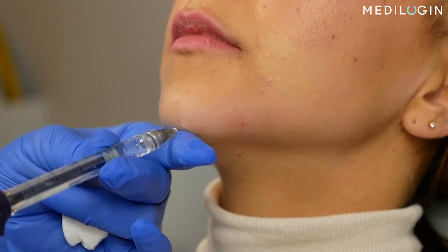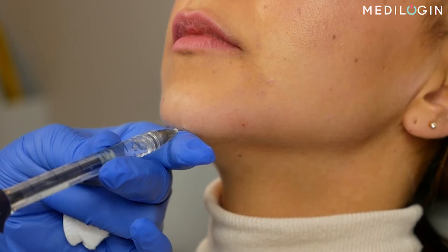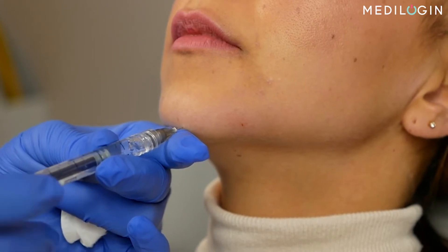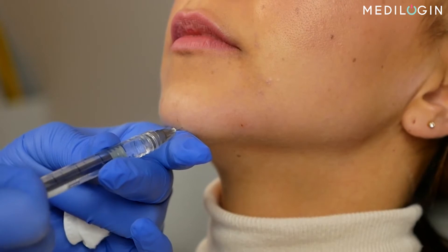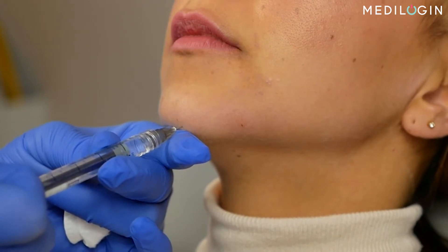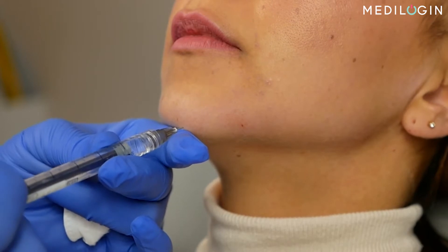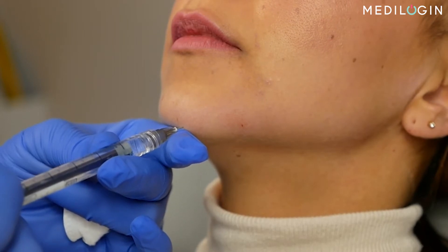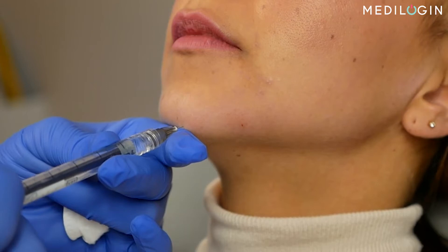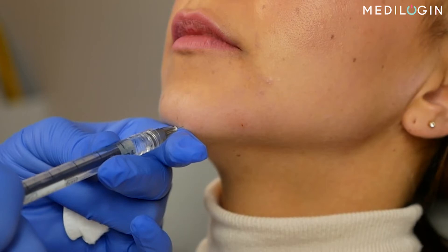Aspirate over several seconds before slowly injecting a small volume of hyaluronic acid. Apply even pressure to the plunger, and deposit the product deep into the tissue. During the injection, observe how the tissue fills up and gains volume.